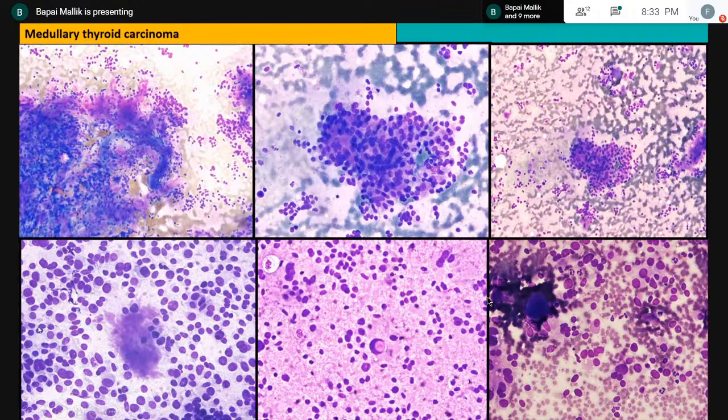This is pretty helpful. A very isolated population of cells, separate, dispersed cells. This material is most likely amyloid. And the cells show anisonucleosis, an isolated population of cells showing anisonucleosis, very commonly found, I'd rather say, in medullary thyroid carcinoma. Once again, you see a very similar pattern.